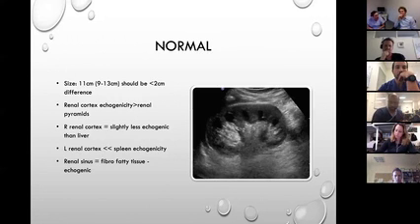All right, on the Morrison pouch or the normal EFAST view or something like that, you can actually have a quick look at it. There are other causes. Sorry, Vijay, can you say that for me again? Yep. The liver's echogenicity and the renal cortex echogenicity should almost be the same.